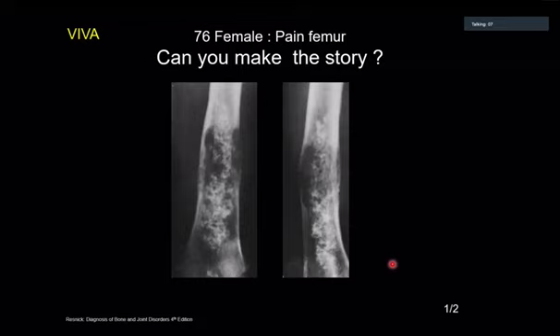I would do MRI, although this is quite suggestive on the X-ray, but I would do MRI for completion and refer the patient to the regional sarcoma MDT. Okay, thank you very much. Number 7, you can mute yourself.